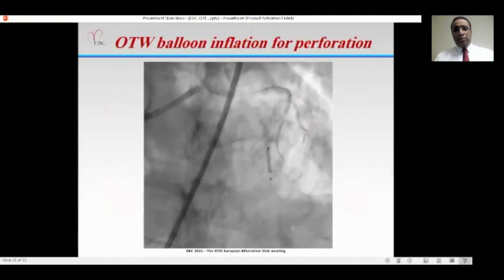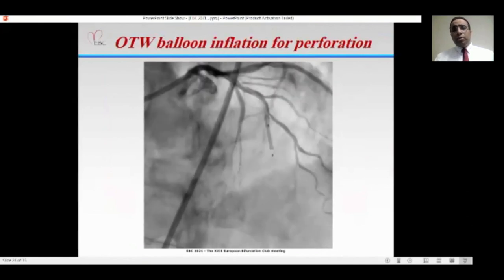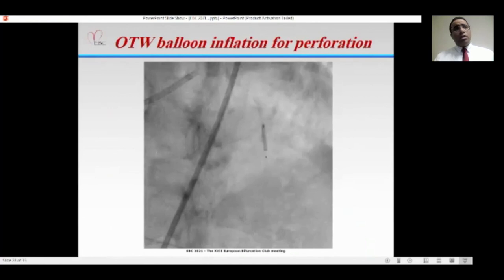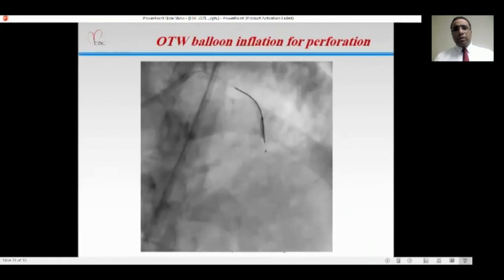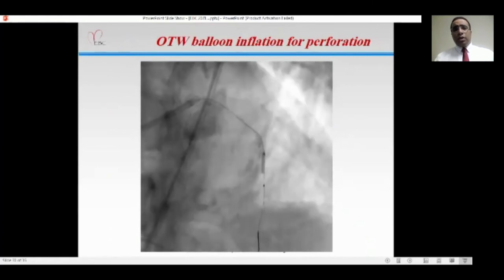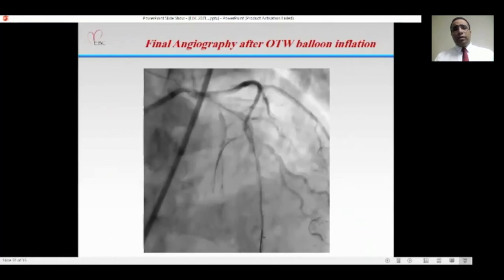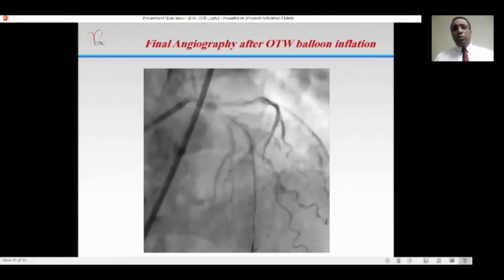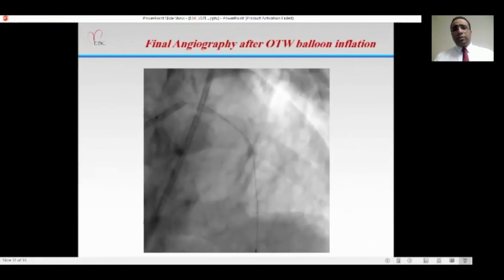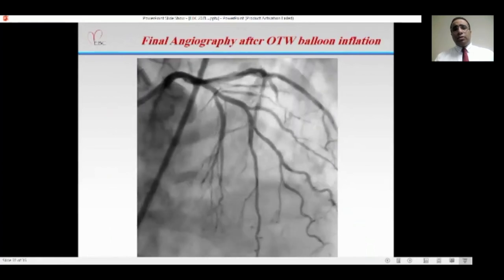Here, I blocked and inflated the balloon at nominal pressure. I think it was 8 or 9. Then I put in the guide wire, deflated the balloon, and reevaluated. And this is the final angiography after the over-the-wire balloon. The perforation is sealed. Good TIMI flow. This is another projection.